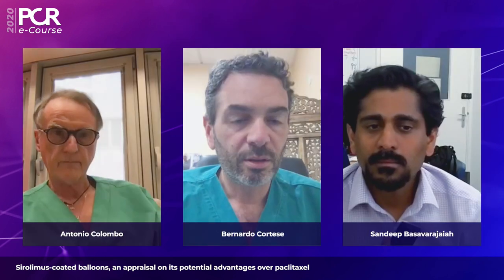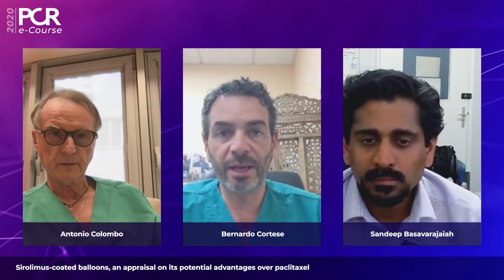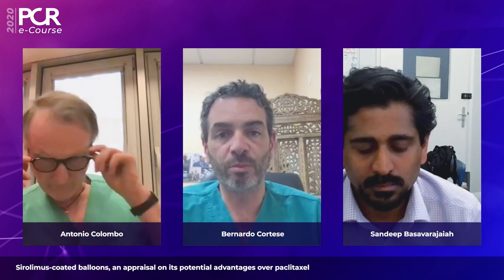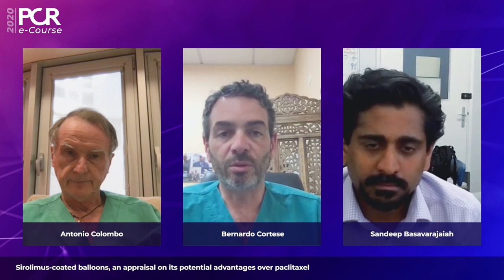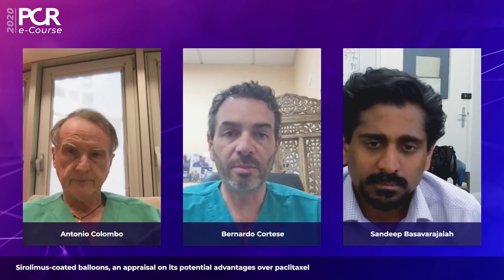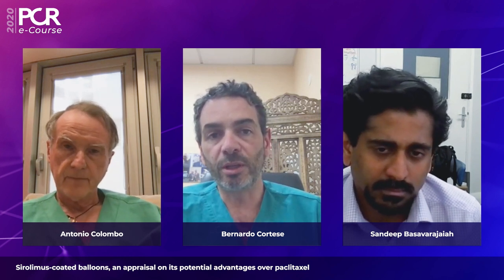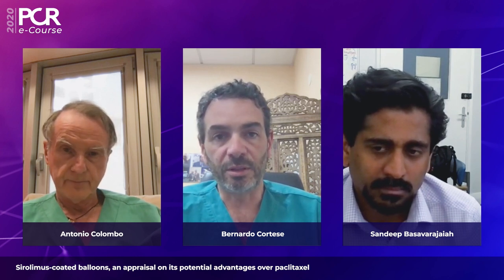Thank you very much. Okay, so thank you, Sandeep. Antonio, we have seen very beautiful cases with this device, and I think that you have underlined some of the key messages that should be followed when we have to face DCB PCI. The first one is that it is really key to correctly prepare the lesion. And Antonio has shown us how this is clearly correlated with the failure or not of the DCB PCI. And the second point underlined by Sandeep is that you should keep the stenting rate with any type of stent as low as possible after DCB.